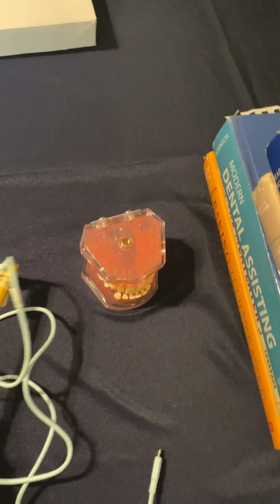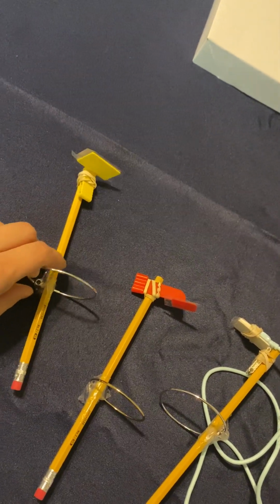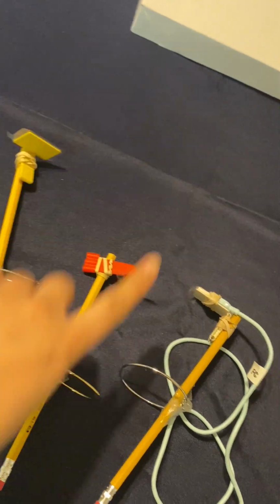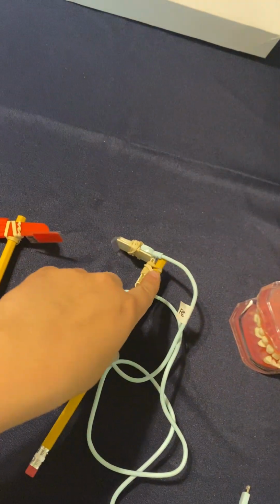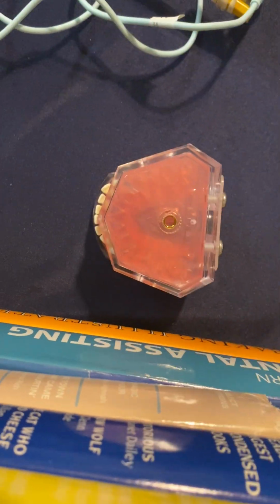Alright, for today's video, we're doing a full mouth sequence. I got my Typodont. I got my 3 Meg-Shift. Hopefully that'll stay together. I was messing with them earlier. So I got the posterior, the bite wing, and the anterior, which I have set up because we're going to do that one first, and Meg-Shift tube head. Alright, so let's get started.